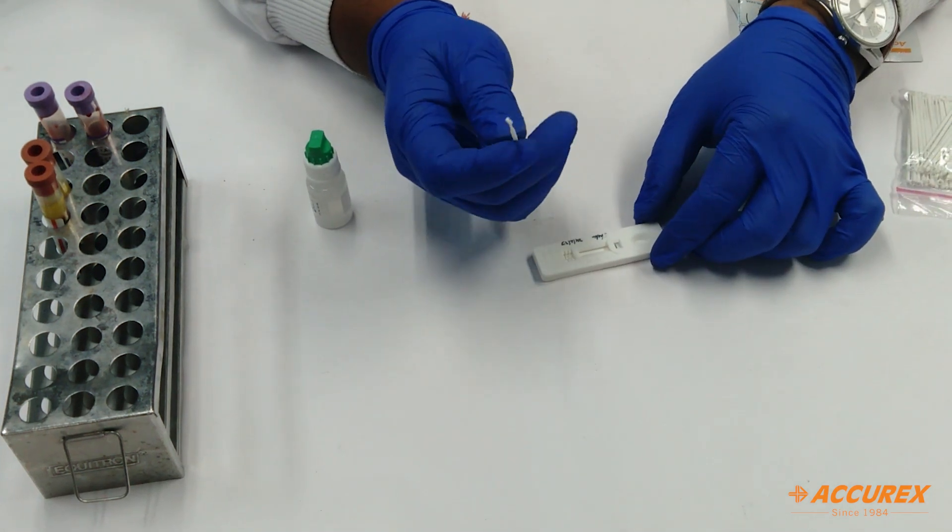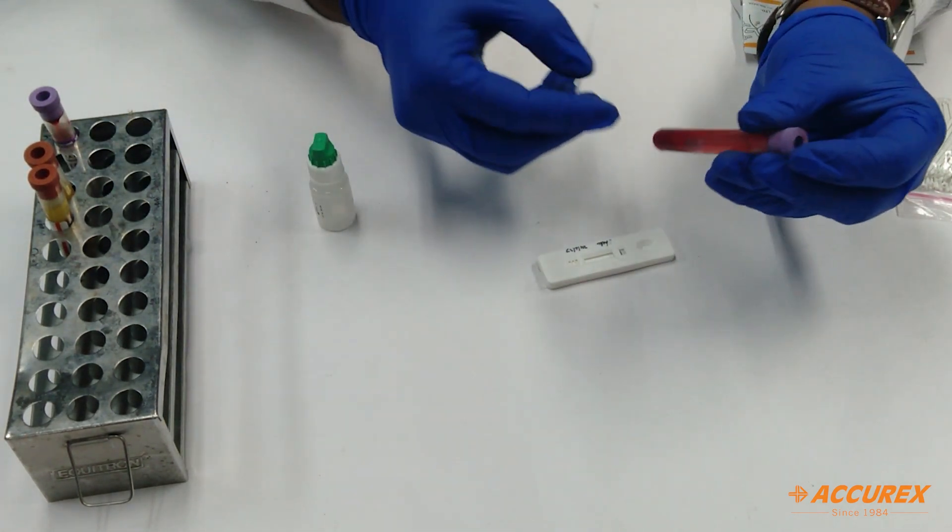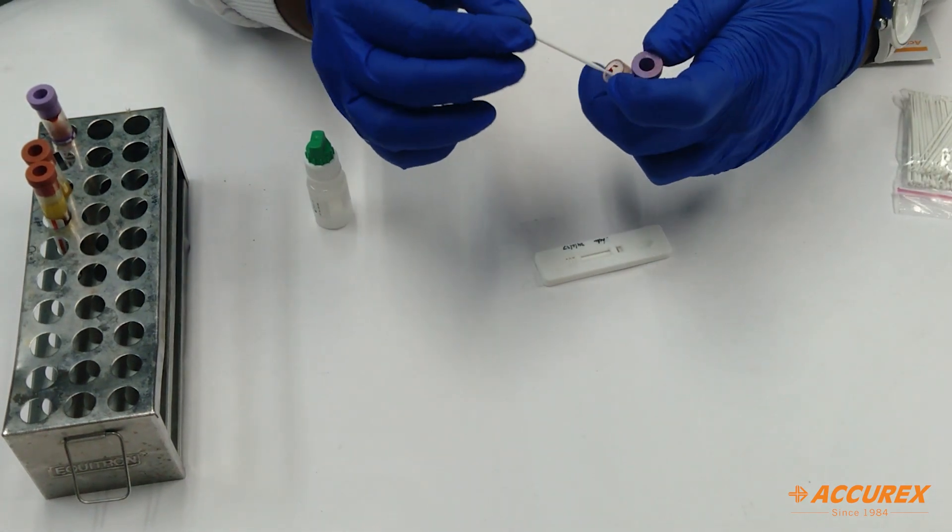You will get the dropper with which you can collect the sample. So I already collected a sample in the EDTA tube. Just we need to take 5 microliter sample from the tube.